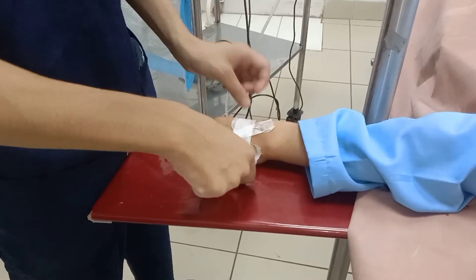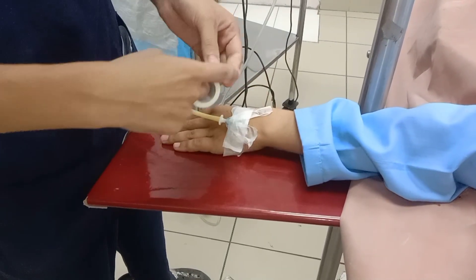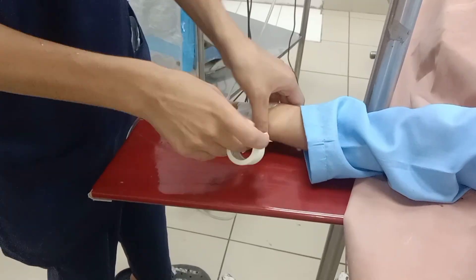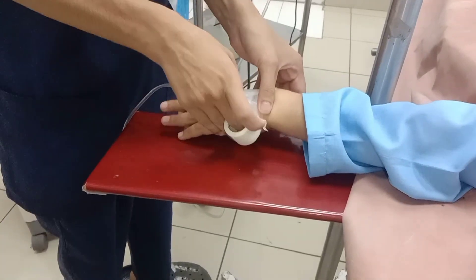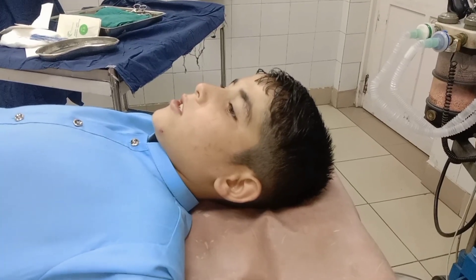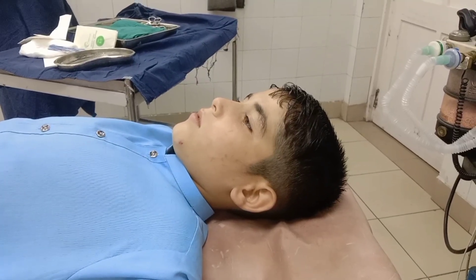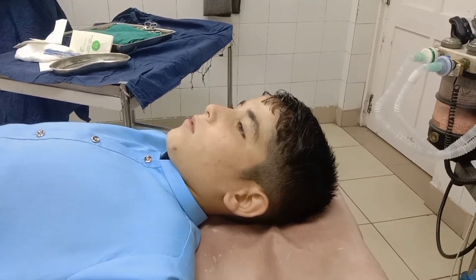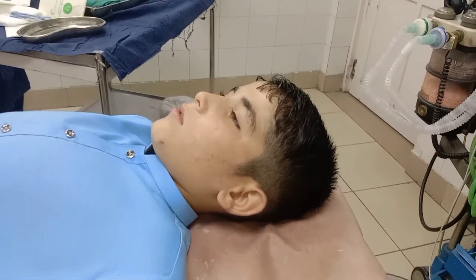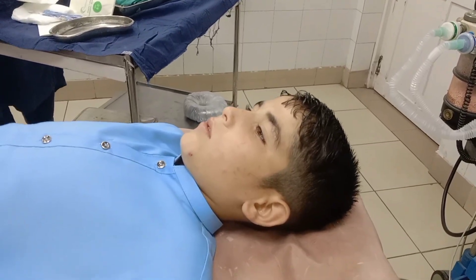The pediatric patient was transferred to the operating table and positioned supine. Standard monitors, including pulse oximetry, non-invasive blood pressure, and ECG, were attached to ensure continuous observation of vital parameters. Intravenous access was secured and baseline vitals were noted.